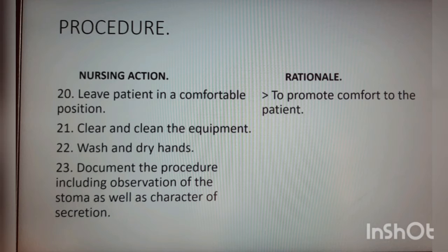Next, leave the patient in a comfortable position to promote comfort. Next, we have to clear and clean all the equipment that has been used for the tracheostomy care. Next, after cleaning all the equipment, we have to wash and dry our hands.